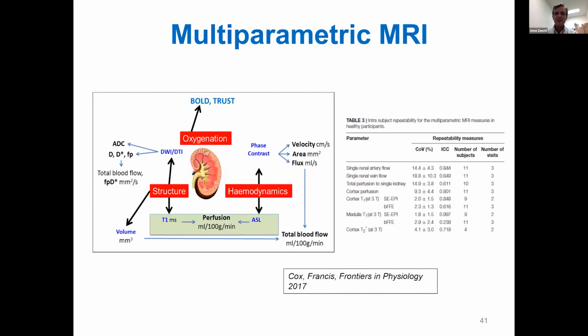This is the slide I wanted to show. So we should all memorize the formula shown on this one. No, just kidding. So we have to take this factor into account. And of course, another way of taking this into account is performing different techniques of MRI during the same session that could also measure the renal blood flow, for example, using arterial spin labeling. As I said in the beginning of this talk, we can really quantify corticomedullary blood flow, combine this with BOLD MRI data, and understand better what happens.